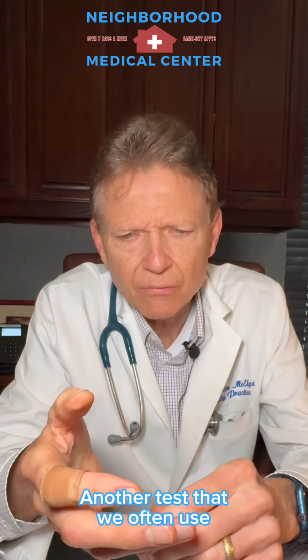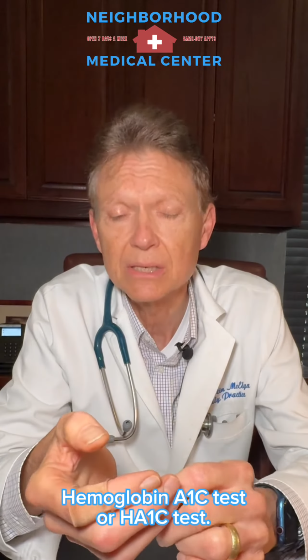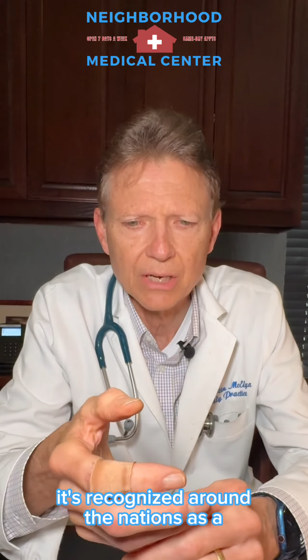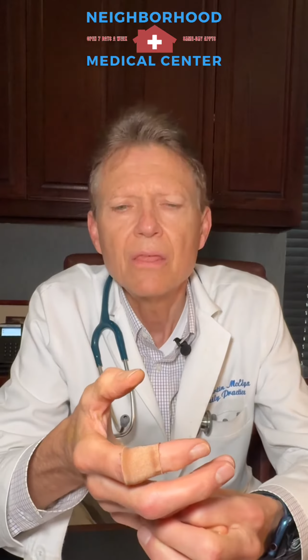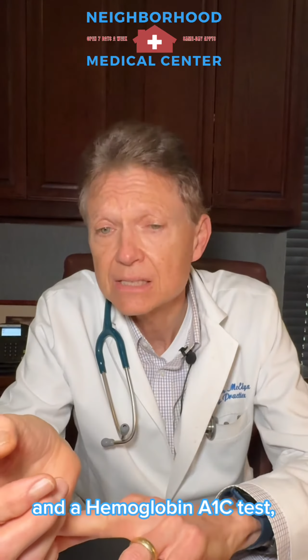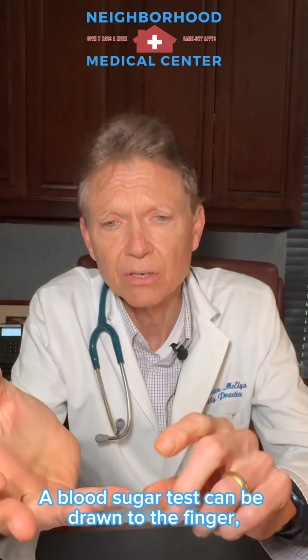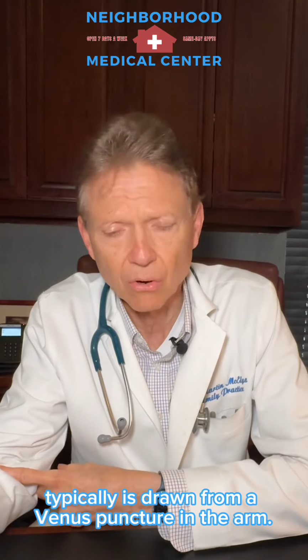Another test that we often use is something called the hemoglobin A1C test, or HA1C test. It's a very commonly used test. It's recognized around the nation as a reliable test for looking at individuals' blood sugars. The difference between a fingerstick blood sugar test and a hemoglobin A1C test is, number one, the places they're drawn. A blood sugar test can be drawn in the finger. An A1C test typically is drawn from a venous puncture in the arm.